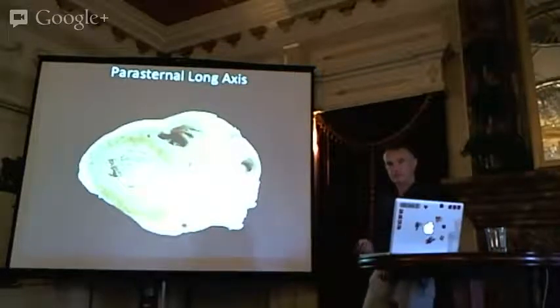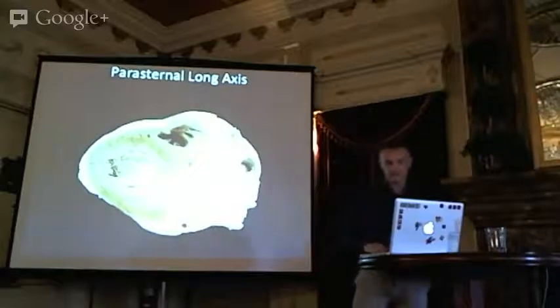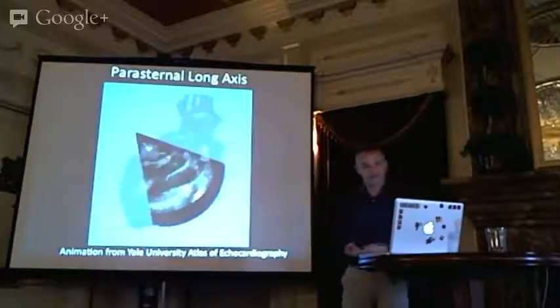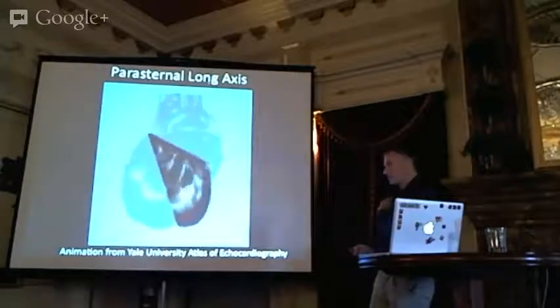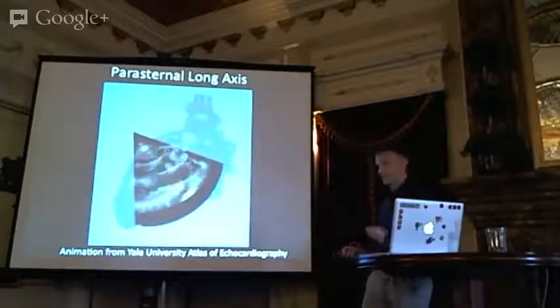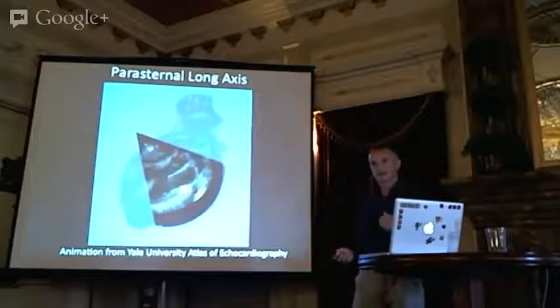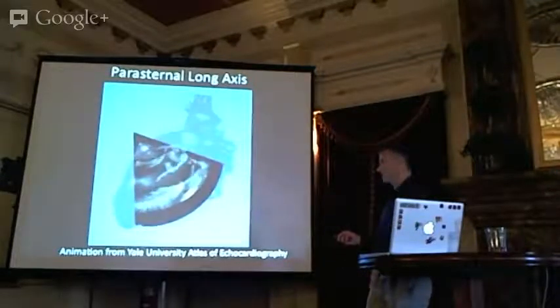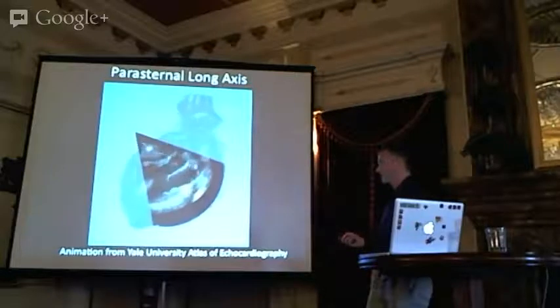Okay? Not an intuitive view for most of us when we start doing this, but repetition is the mother of skill. What I'd like you to do if you are new to this is get as familiar as you can with what the view is supposed to look like, and then start scanning the patient and try to achieve that view. It's going to be fairly easy to interpret with big stuff. So slicing through right shoulder to left hip, starting at about the fourth intercostal space, just to the left of the sternum, go up and down the space. If you can't find it, it's going to look like that.